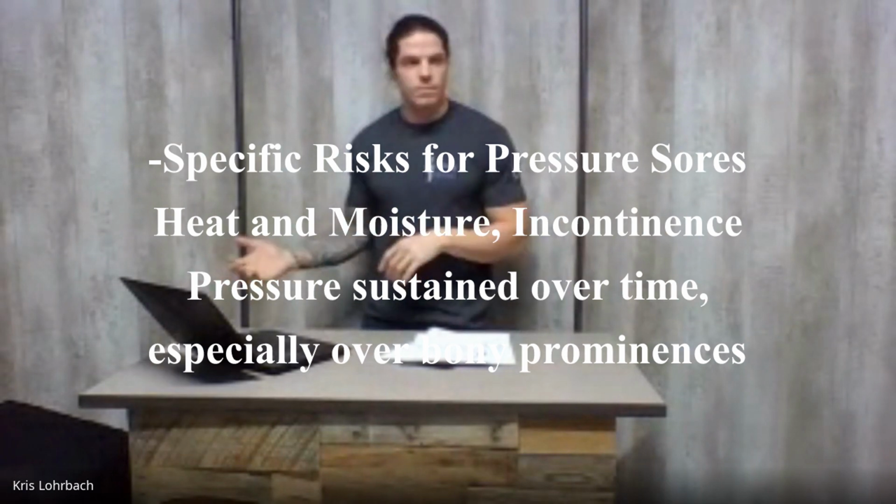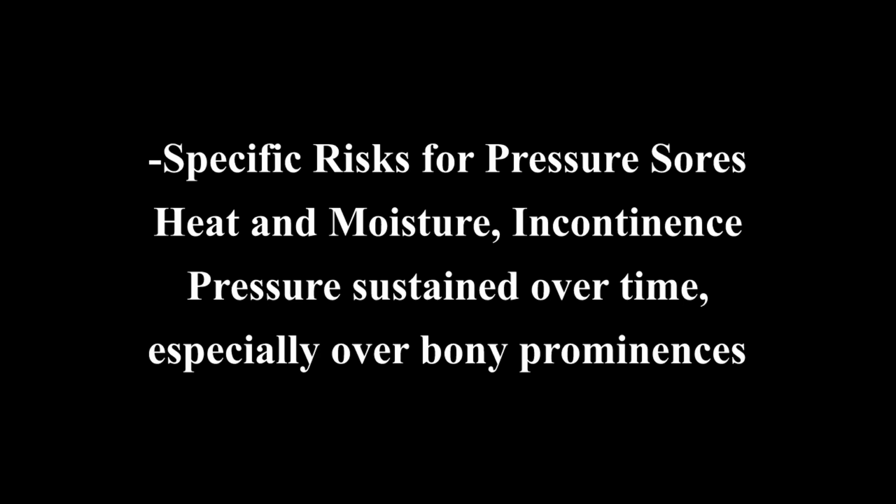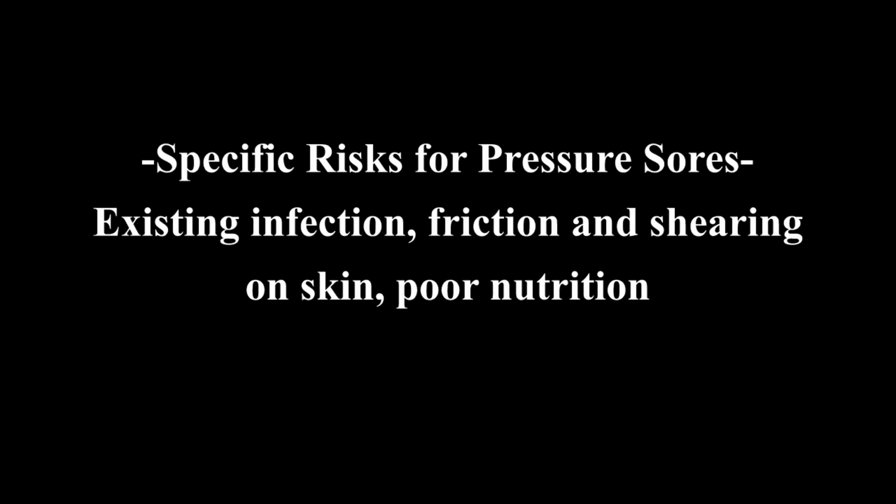So some more specific risks are heat and moisture, and then others: incontinence, not being able to control urine, older age, and existing infection, so an infection anywhere in the body. Day to day, we run into seats and backrests a lot, but the armrests, chair height, and those other metrics generally are going to come with custom wheelchair fitting, which eventually we're going to get you into, Jake.